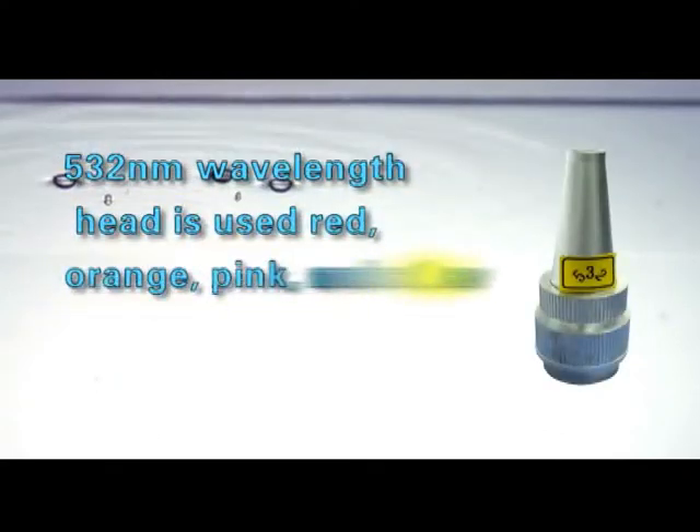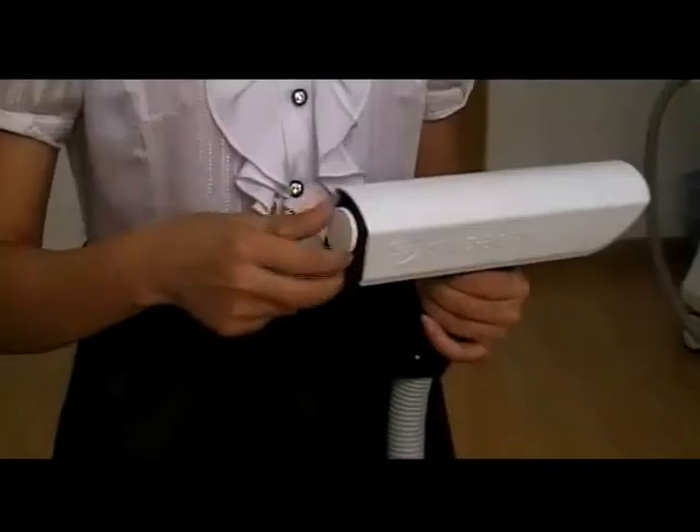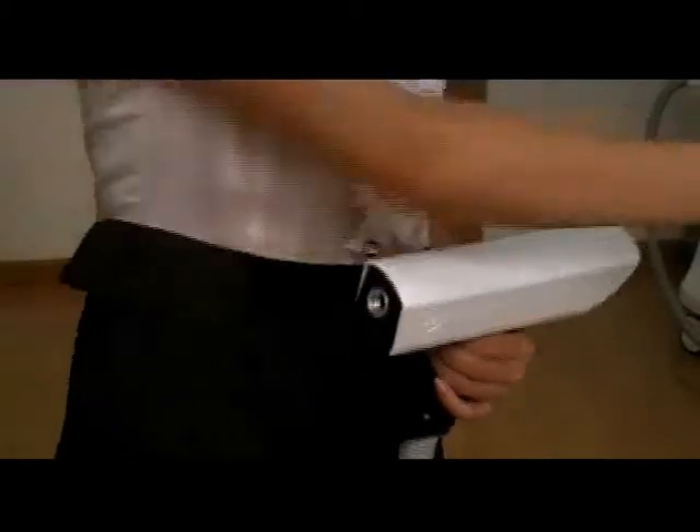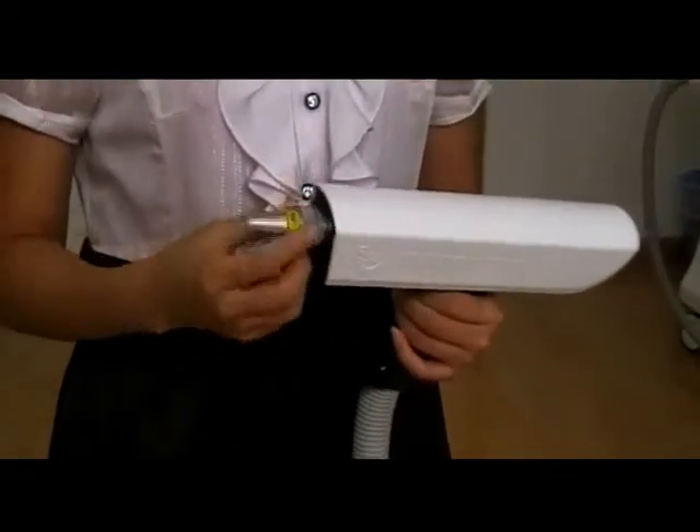The 532 nanometer wavelength head is used for red, orange, pink, and other lighter color tattoo removal. The protective cover should be taken off first, then screw the treatment head carefully but do not screw it too tight.